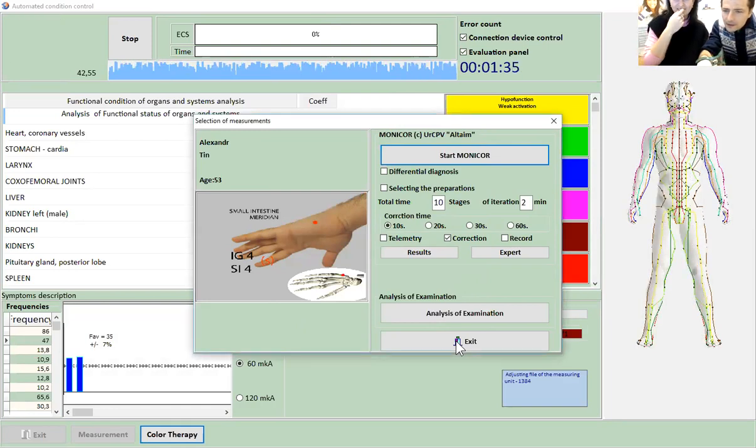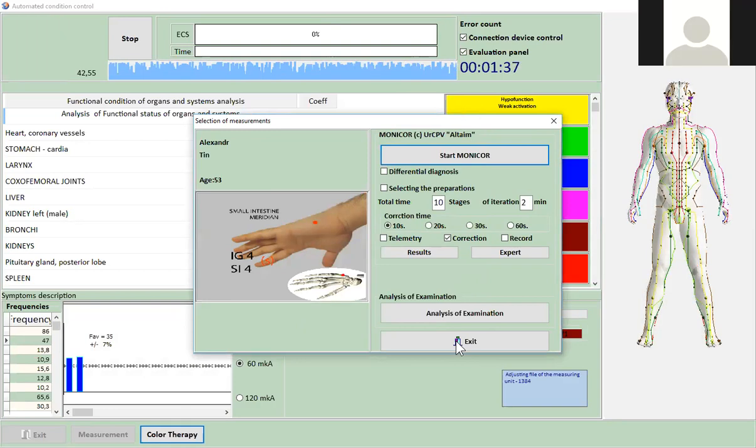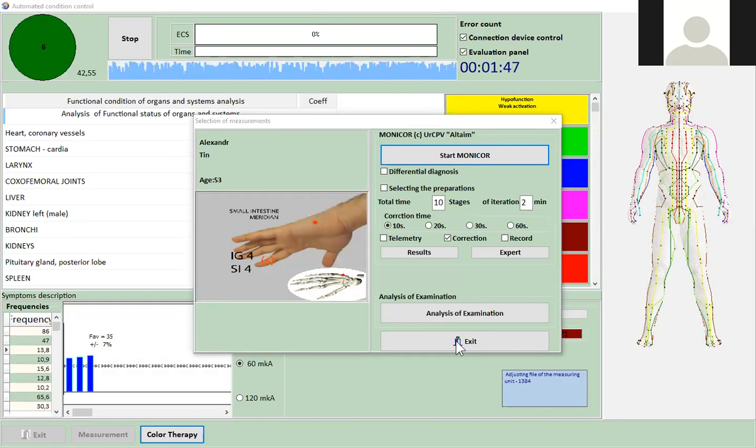So Victoria, the ECS was like 26 or 27 originally, and then it just went up to 53. So is that showing the improvement?